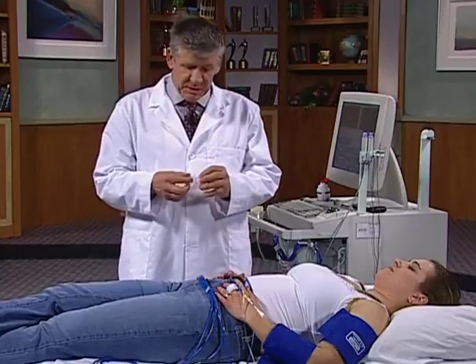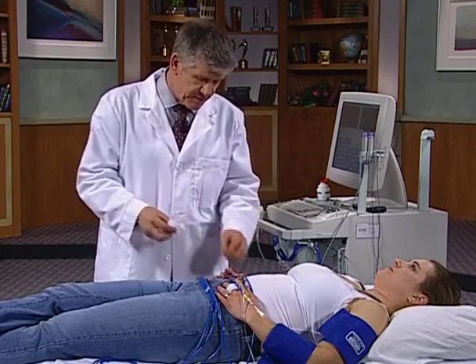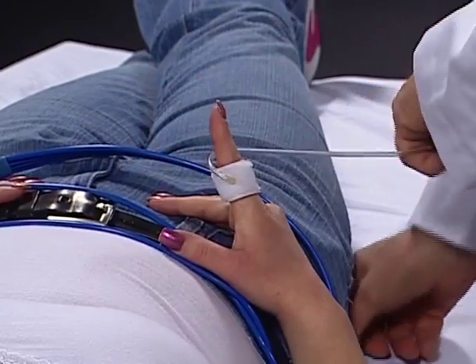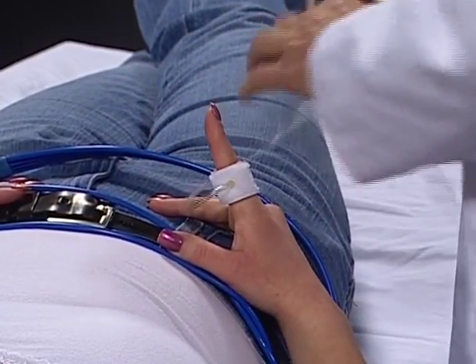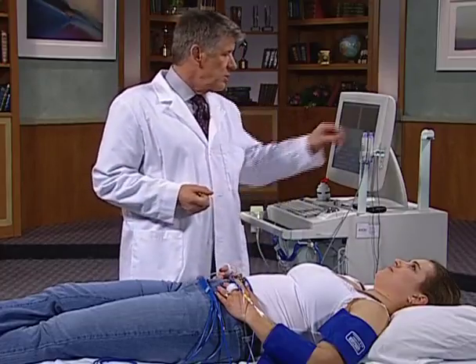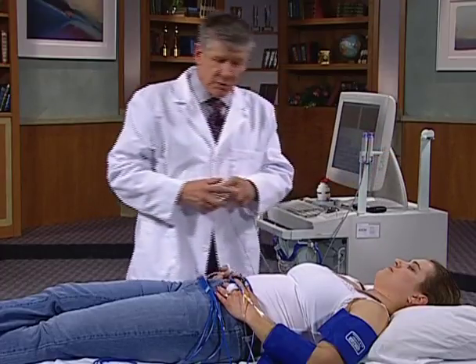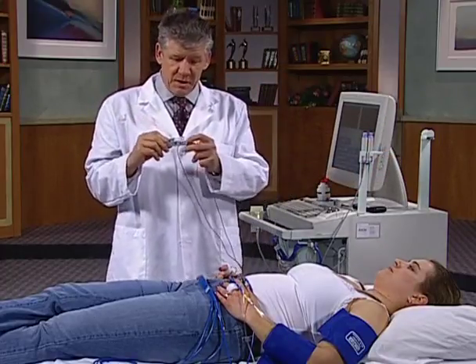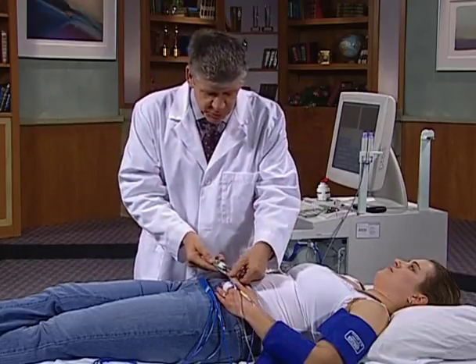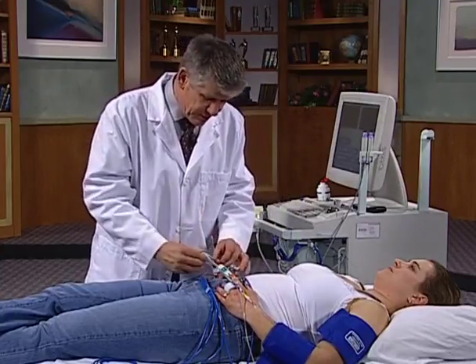Also, we may use these digit cuffs. The digit cuffs are either a 1.9 or a 2.5 size. Now, we have a choice during digit examinations of either using pulse volume recordings from the digits, or we can use PPG, or photoplethysmography. For this demonstration, I'm going to apply these PPG cuffs, or sensors. These are little infrared light emitters that will measure the perfusion in the digits. So this is the left side and the right side.